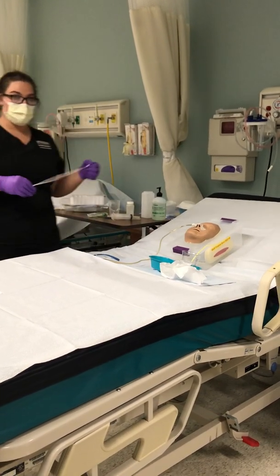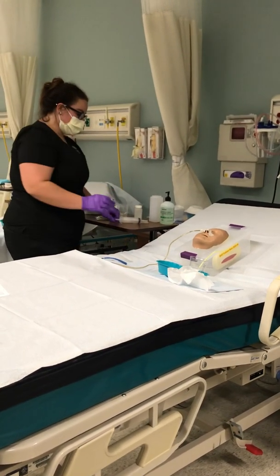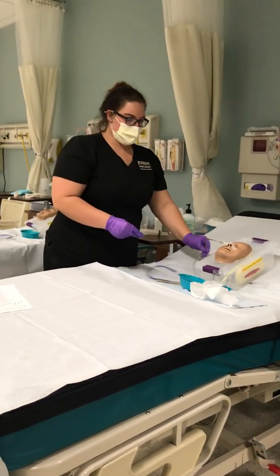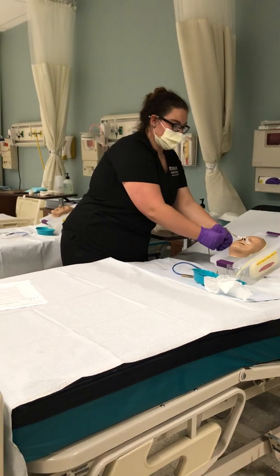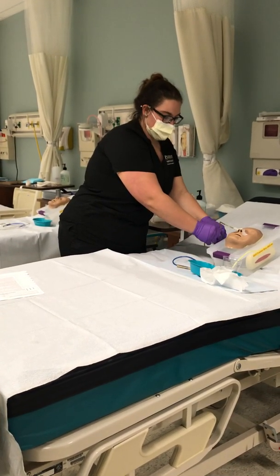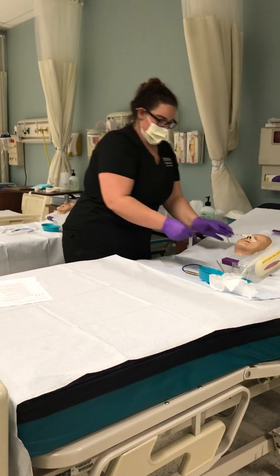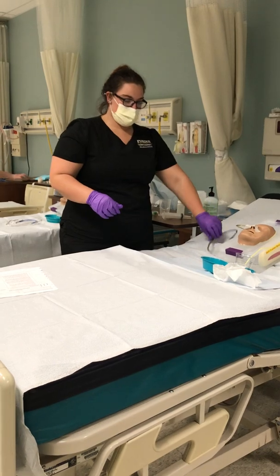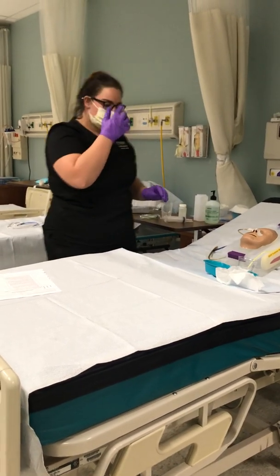So document your measurement. Once you have that done, you'd want the patient to face towards the opposite side, so you give them a little room. You would secure it onto their gown with a pin, or maybe here with a button or something. Secure that down. If you have a double lumen, you want to make sure that it is above the patient's stomach.